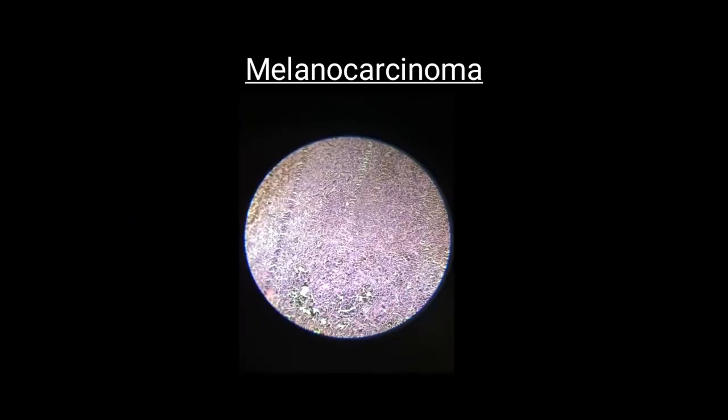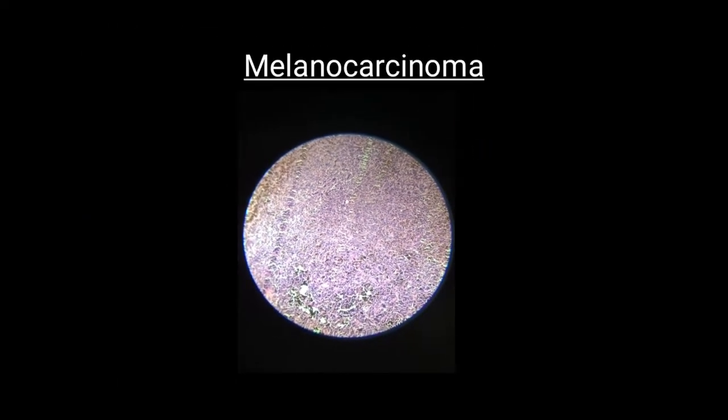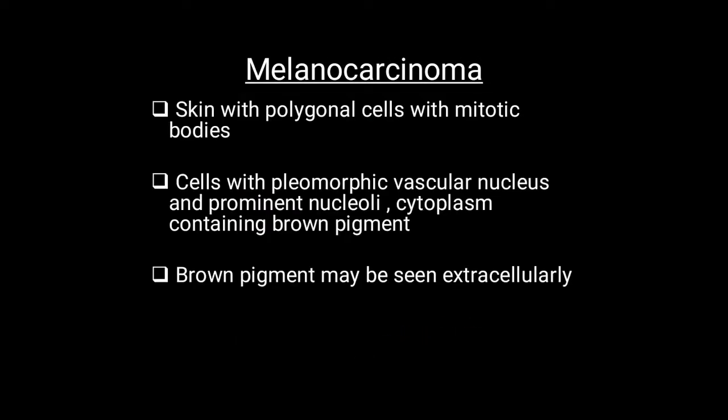The next is melanocarcinoma or malignant melanoma. Here at the 6 o'clock position and 10 o'clock position you can see the melanin deposition in the tissue, though the structure of the skin is not so clearly appreciated here. Now come to the points.